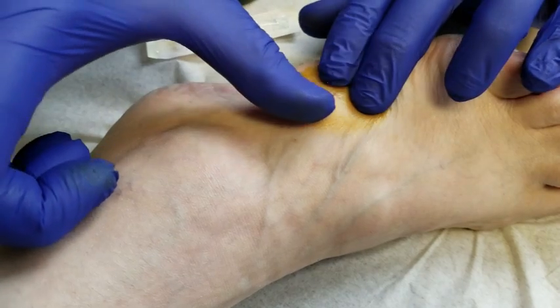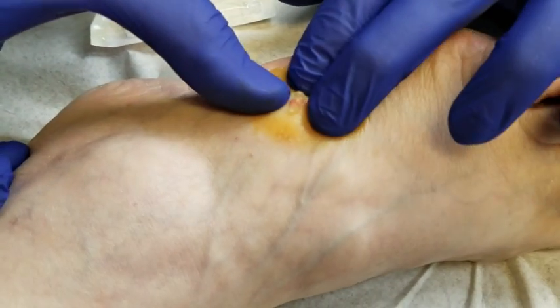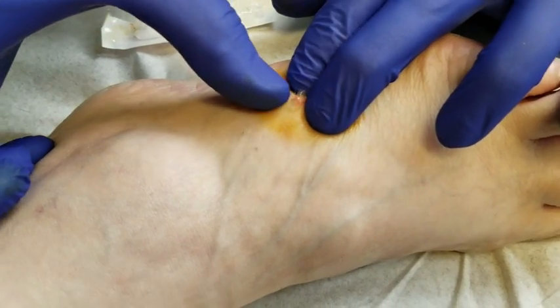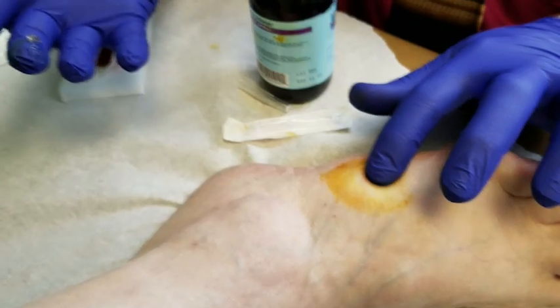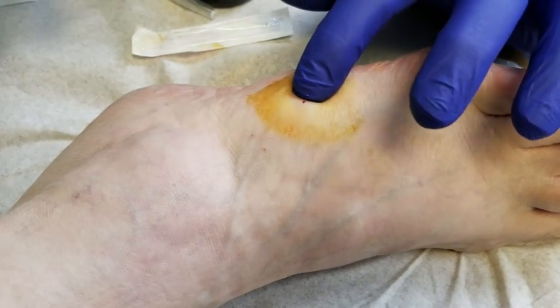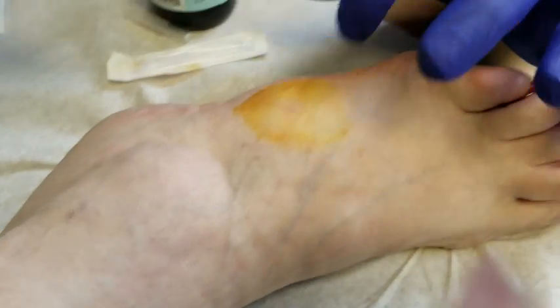You can see now it's nice and flat. I'll try to squeeze out a little bit more — it's almost like popping a pimple. You can see now it's flat and all the fluid's gone. She'll come back in every two or three months to aspirate it as necessary. And that's it. Thank you.